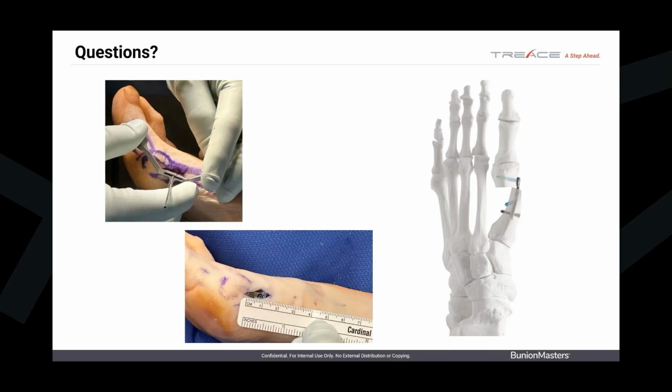So if you have to remove it, you find your bicortical screw, you remove that under a cannulated environment, and then you make your 1.5 centimeter incision, backing out your head screws and your angled screw. And then what you'll do is just take a very thin chisel, the thinnest you have in your set, and you'll just tap it down the medial cortex of the shaft that's remaining, and tap it down behind the implant, down the center of the shaft, and then this implant will come right out. You won't have to remove many. It is not going to be palpable.